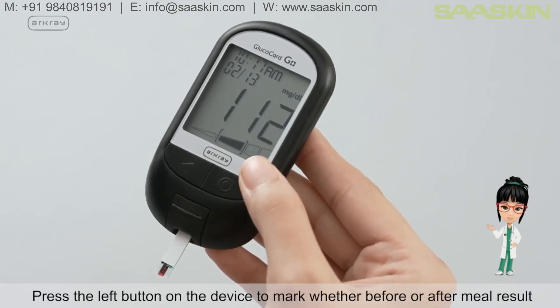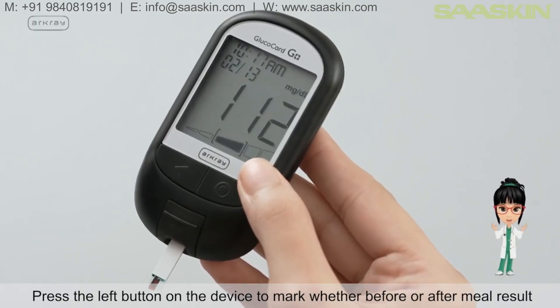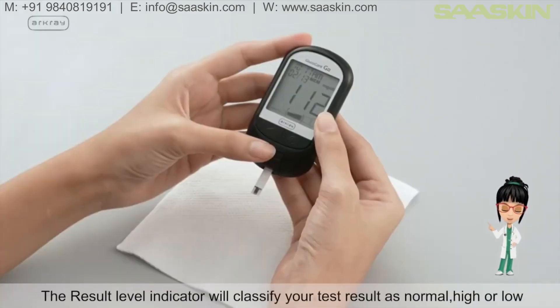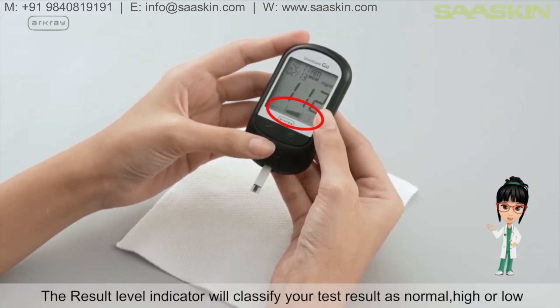Press the left button on the device to mark whether it is a before or after meal result. The Result Level Indicator will classify your test result as normal, high, or low.